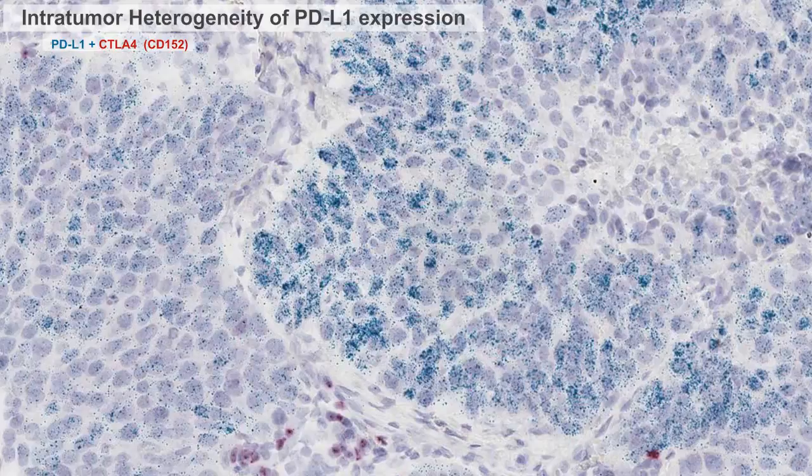Starting from the left-hand side, PD-L1 is expressed in most of the cells at a high amount. Going towards the center, when we cross the middle divide across the stroma, PD-L1 expression is higher than the first region and slowly diminishes further into the tumor. You'll also notice little pockets of PD-L1 that are scattered throughout the tumor region.